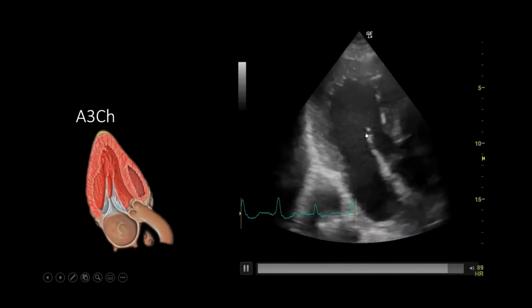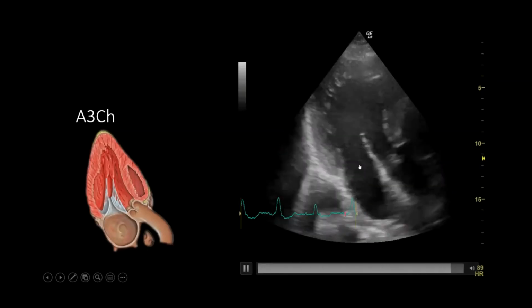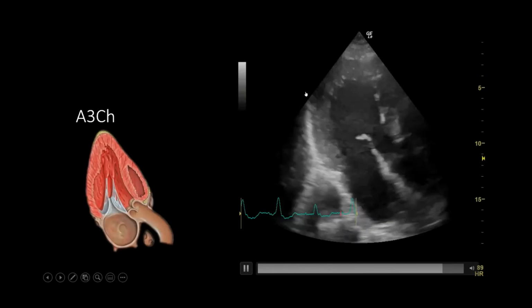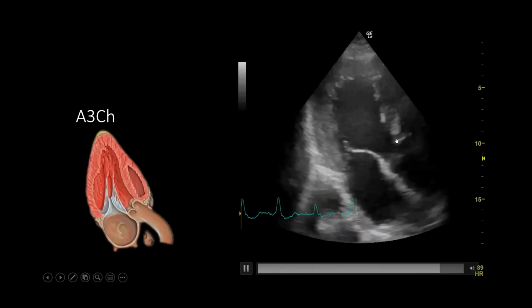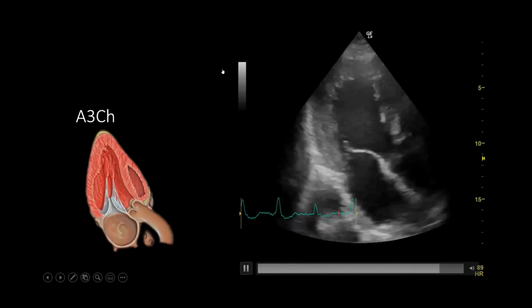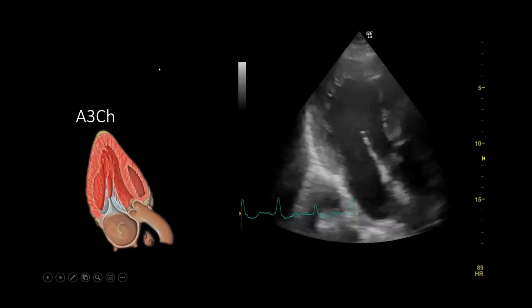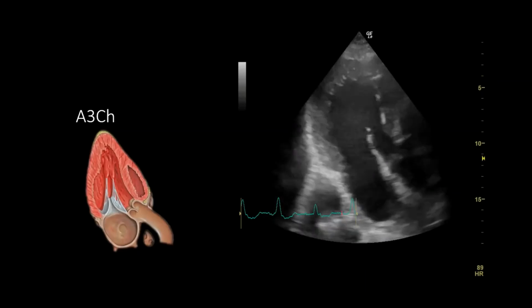This is very much, imagine a parasternal long axis view, but viewed from the apex. Okay, so the aortic valve is down bottom right here, and the mitral valve is here. And again, we can see that this wall here is contracting quite nicely, but the septum, which is on the right, top right of the screen, is again sort of flapping around, not particularly well. So this view can be quite good for evaluating where the regional wall motion abnormalities may be.